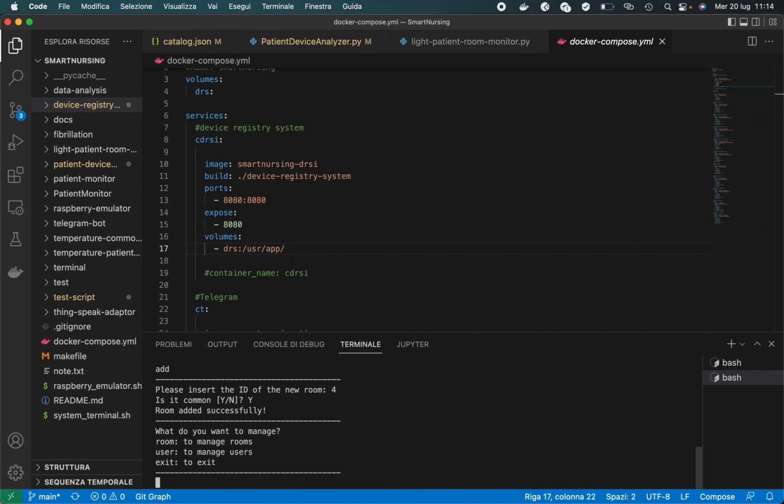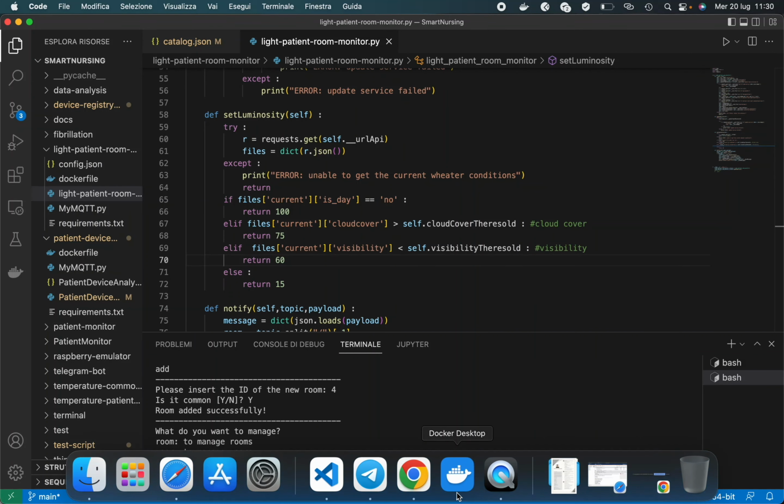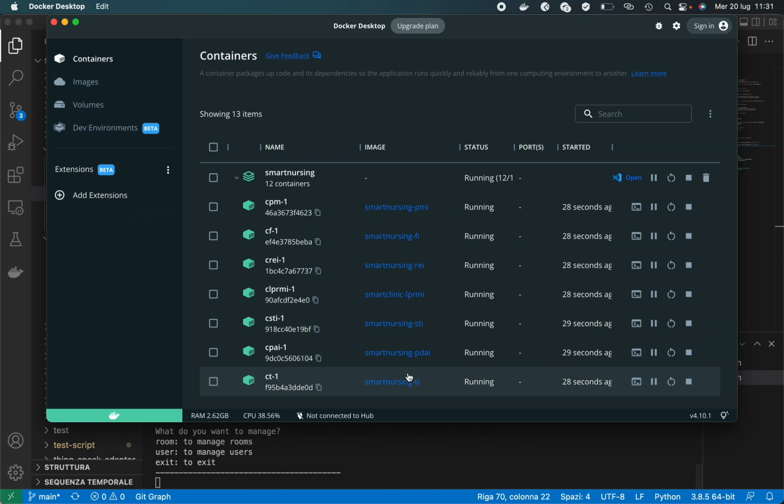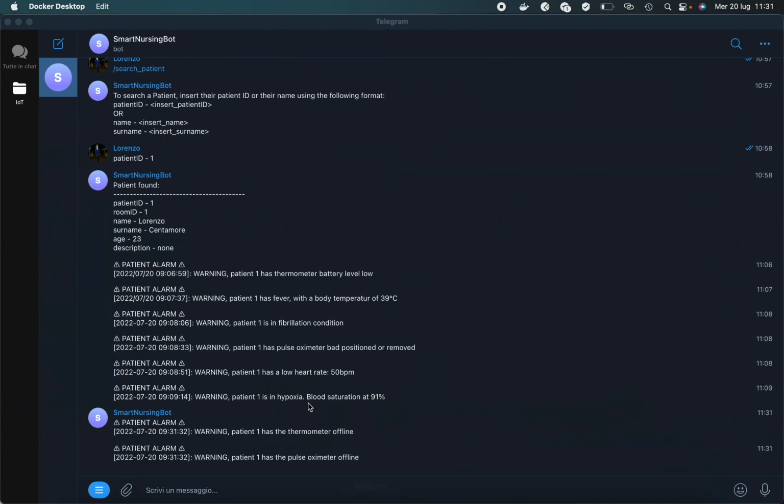In the meanwhile, the Raspberry emulator is sending patient and room data and receiving actuation commands. Since some time has passed now, opening the terminal of the patient analyzer, I can see that the microservice detects the absence of the two sensors and sends the two Telegram notifications.